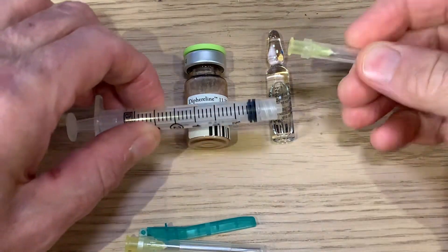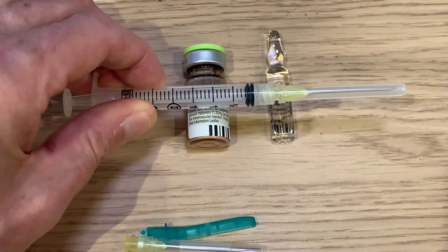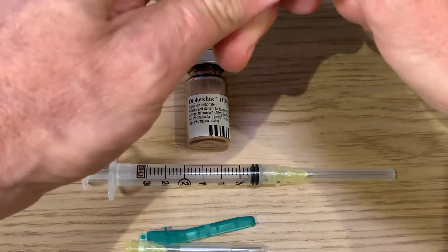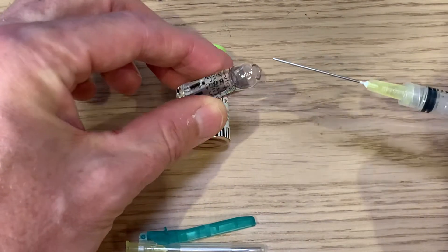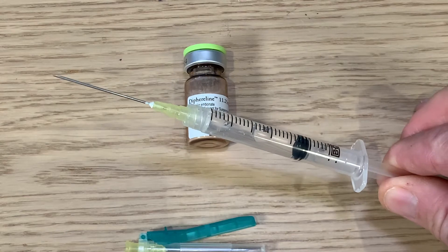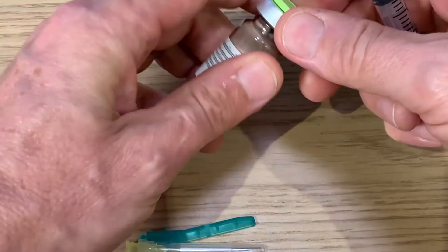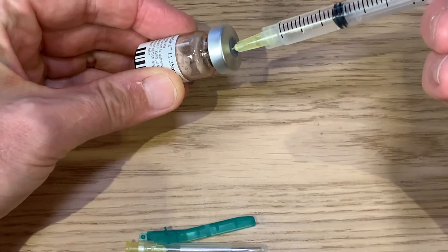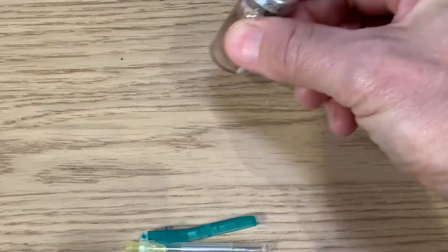One of the needles is attached to the syringe. The saline is drawn up into the syringe, and the next step is to mix this with the dipherulin powder. The fluid is injected into the vial and then the vial is gently agitated without shaking.